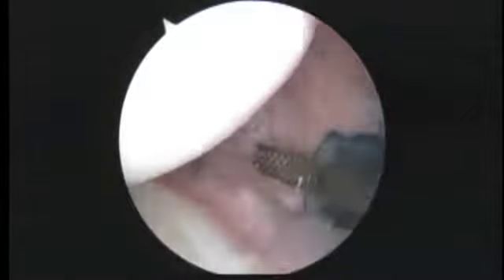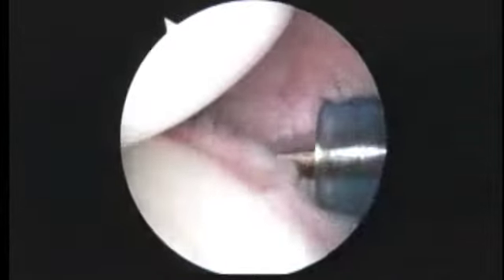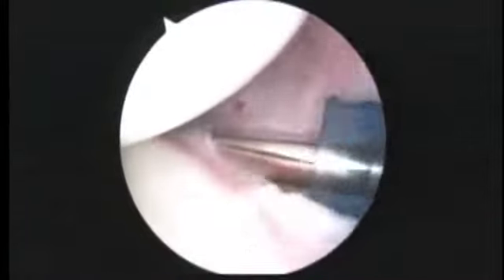Okay, so what we're looking at here is the posterior aspect of your shoulder. We're going to place an instrument in called a rasp, and we use this to roughen up the capsule back here. You can see a little crack in the cartilage. We're going to put in an anchor right here. And because the labrum's a little bit damaged here, see that? We're going to place a suture anchor down to help repair that. Focus. There we go.